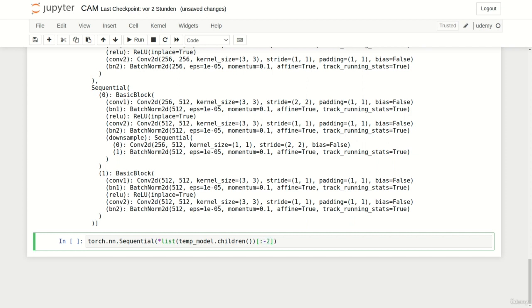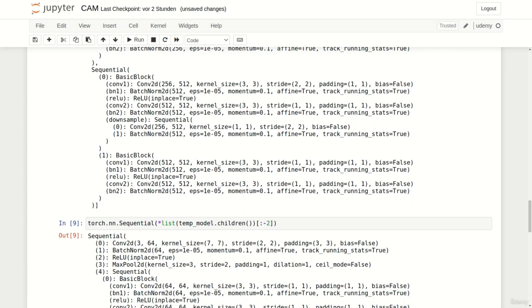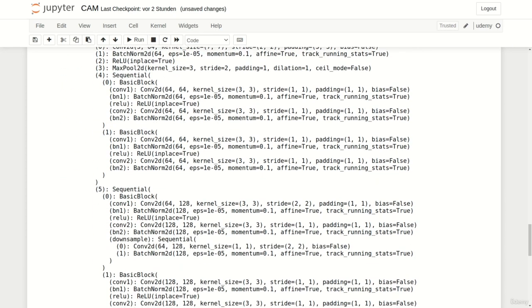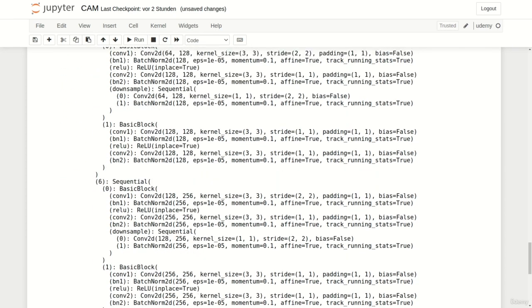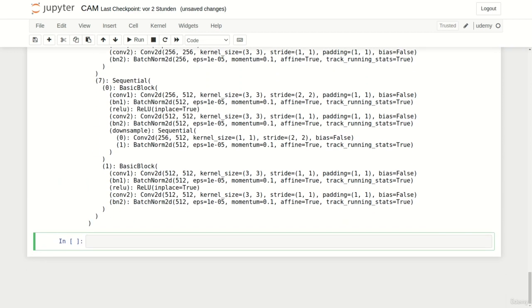We now have our PyTorch model back without the last two layers. Now we are ready to implement our adapted pneumonia model. We simply add an additional output to the forward function which returns the feature map of the last convolutional layer. Note that since we removed the adaptive global average pooling and fully connected layer, we need to manually add them back.